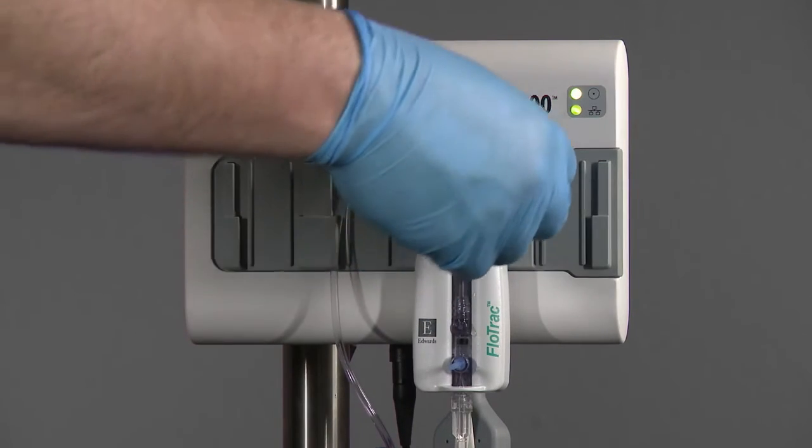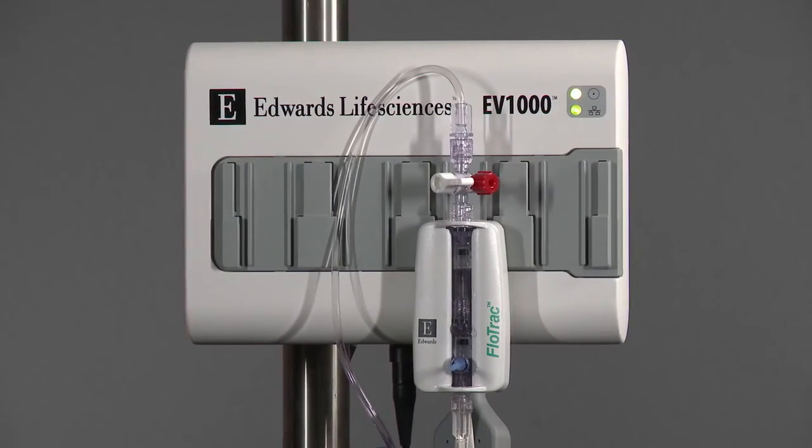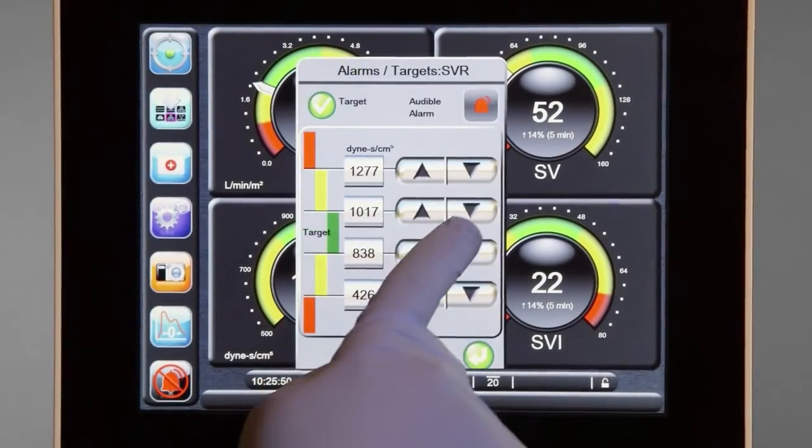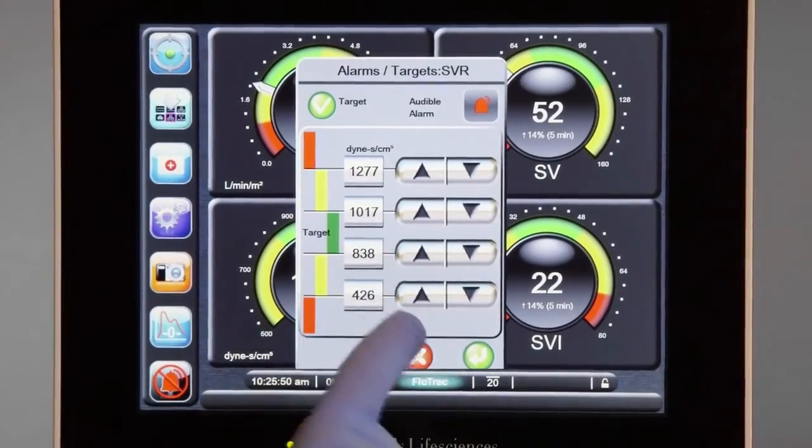If a patient monitor is connected, confirm the presence of the arterial waveform. Set the blood pressure alarms on the bedside monitor as well as the displayed parameters on the EV-1000.